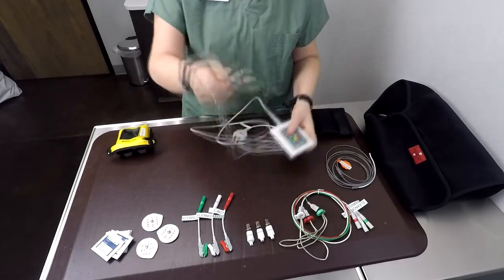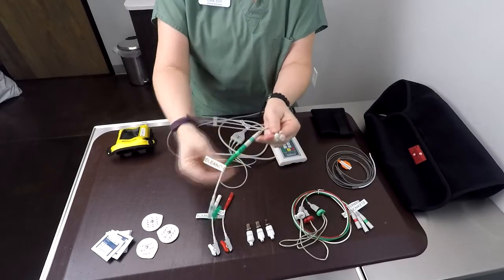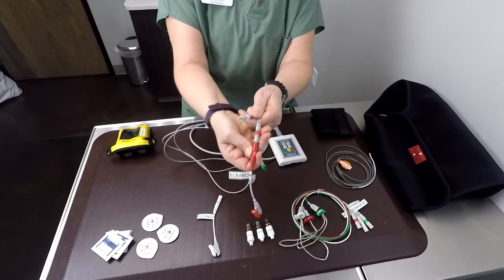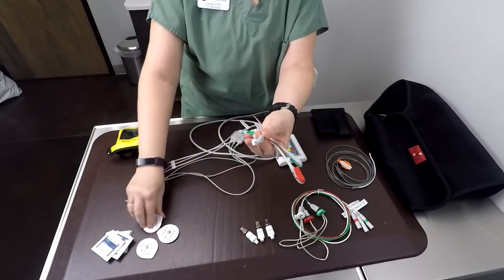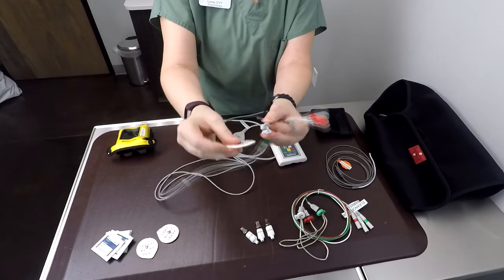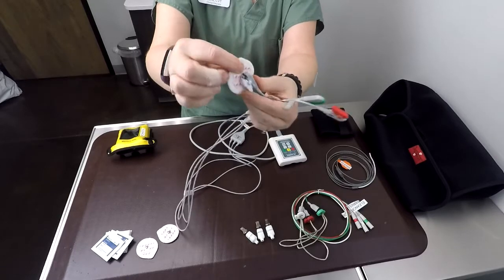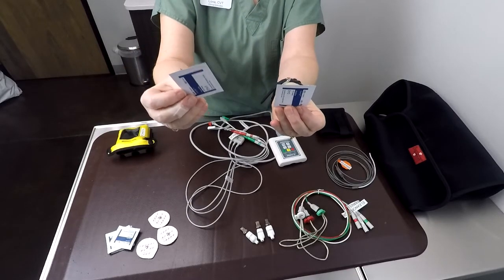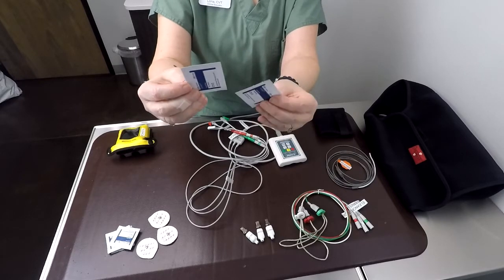Attached to the primary connector cables, you then attach your electrode clips — and again, these are all labeled for the kit they came from. These clips attach to adhesive electrode pads that stick to your patient, and then the clips attach right there and are actually quite secure. Each kit has a supply of alcohol pads, and we'll talk more about how to prep our patients to make these electrode pads stick effectively.